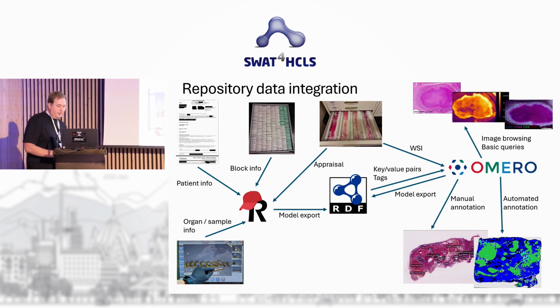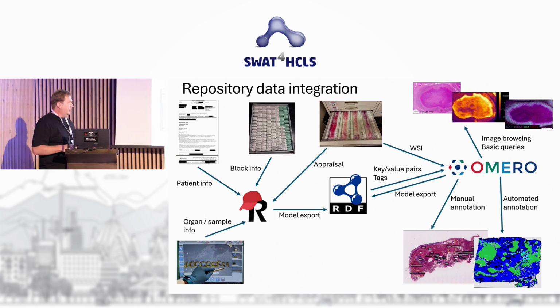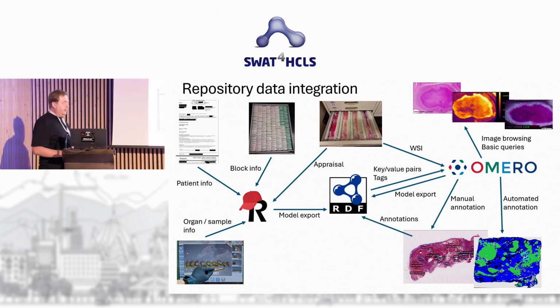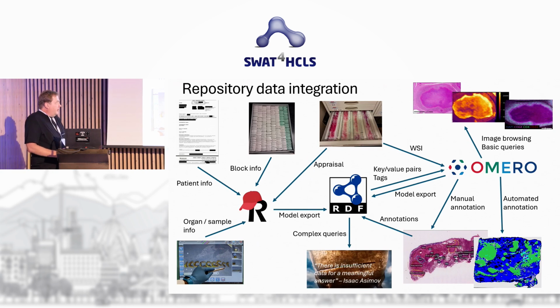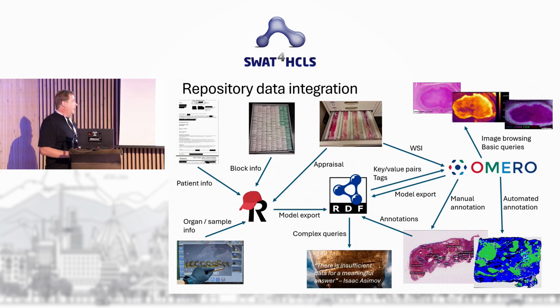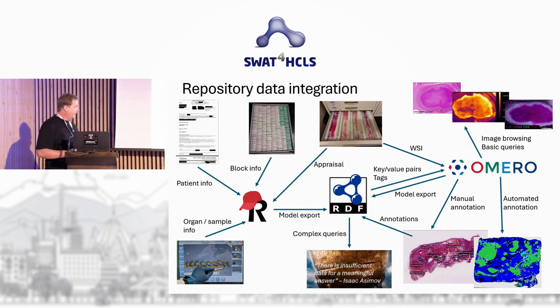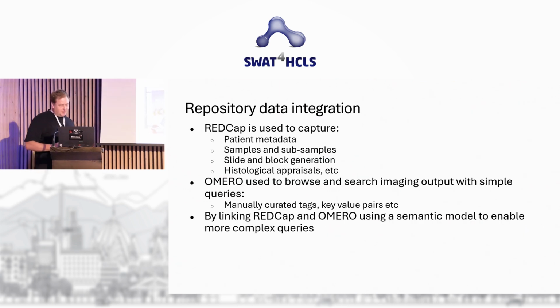And then we have the manual annotations and the auto annotations, and then we get all these regions of interest, or ROIs, from that. Ultimately, we'd also like those annotations to go back into the RDF so we can construct queries using those. So we can do more complex queries instead of just where did something come from. And eventually, we'd like to feed this into some kind of AI or machine learning so that eventually we can maybe stop asking questions. But I think that is unlikely.